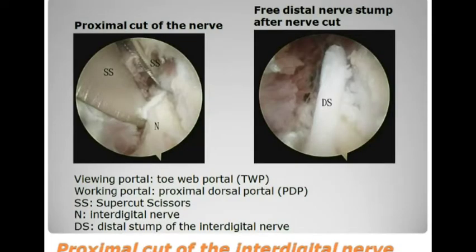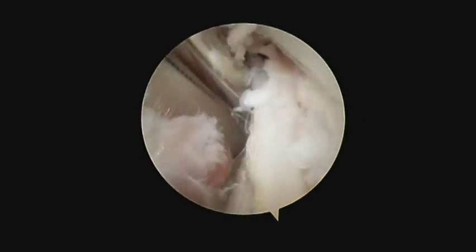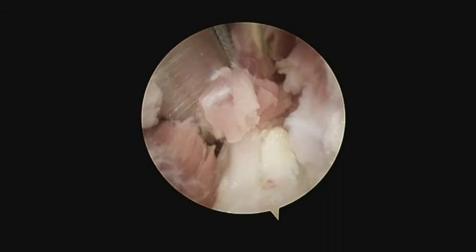The fourth step is proximal cut of the interdigital nerve. This is performed with supercut scissors through the proximal dorsal portal. The blades of the scissors serve as a retractor and retract the muscle proximally to explore the most proximal part of the nerve before nerve cutting.